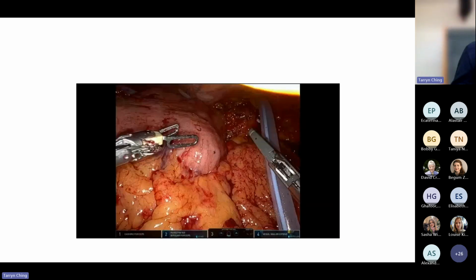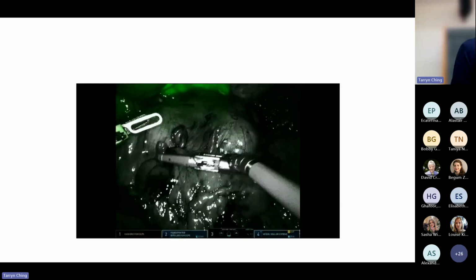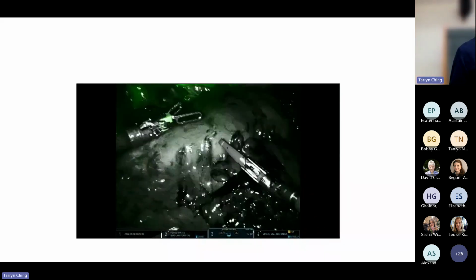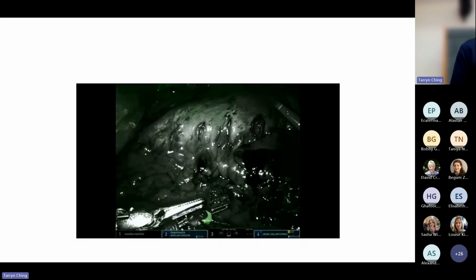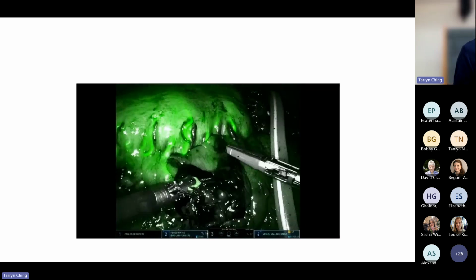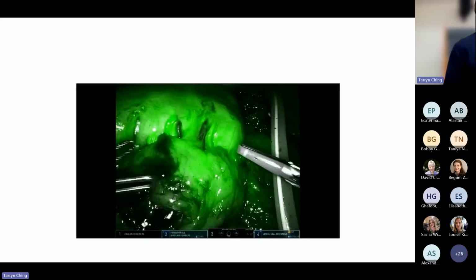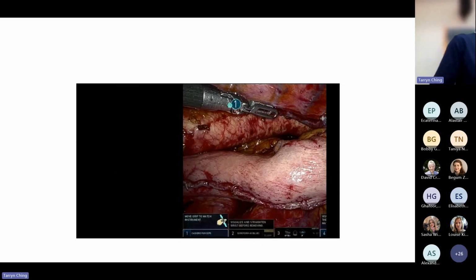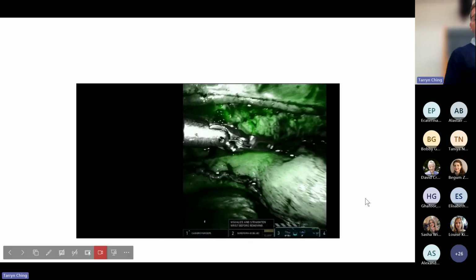This is actually the stomach. I have just removed the spleen in this patient because of bleeding from the spleen. So the oesophagectomy had been abandoned. And before bailing out and taking all the instruments out, I decided to do an ICG pure anatomical study. I'm not interested in perfusion. I just want to know if the right gastroepiploic arcade is intact, in case the patient was going to go ahead with an oesophagectomy at a second stage. This is the perfusion. At the top, you can see the aorta here.